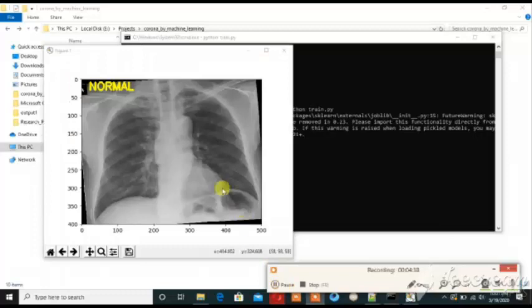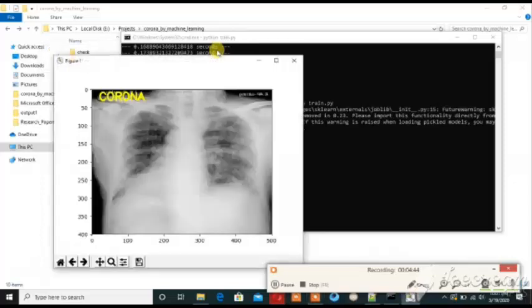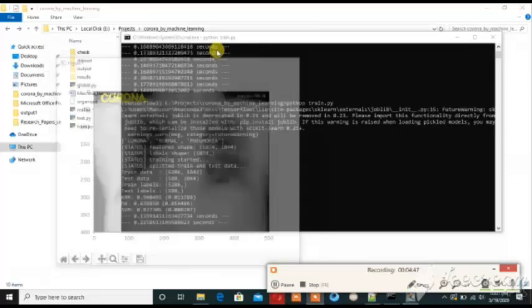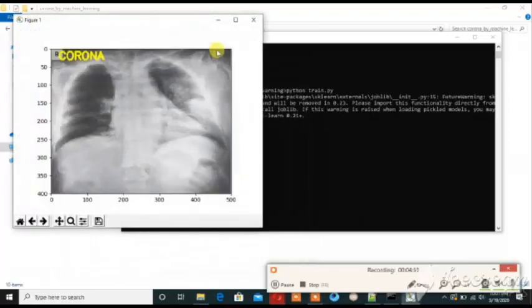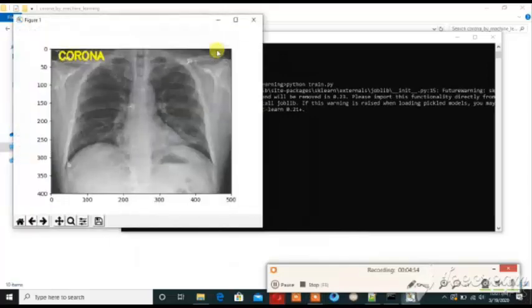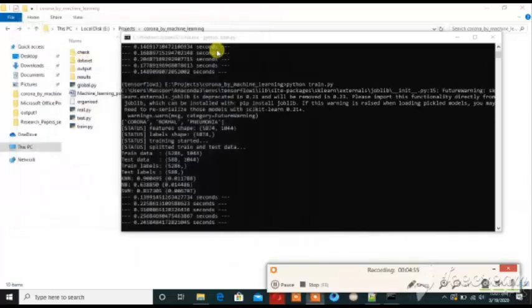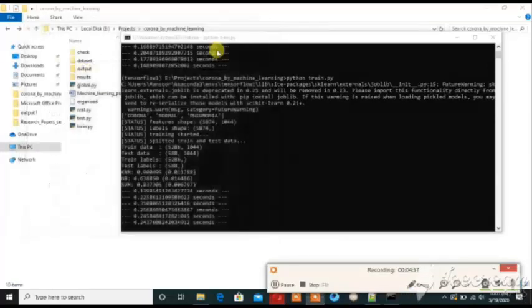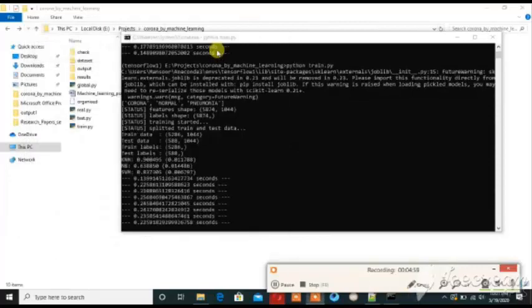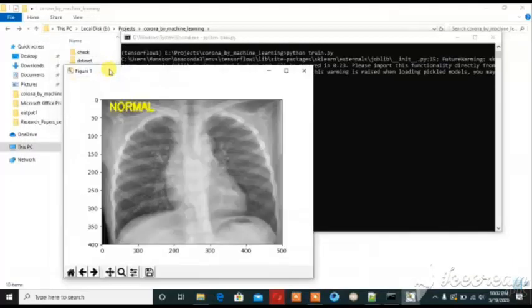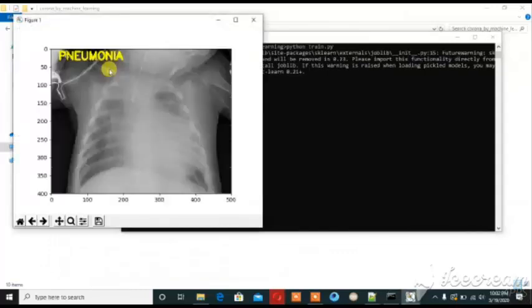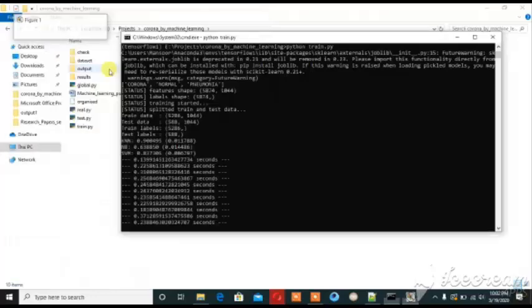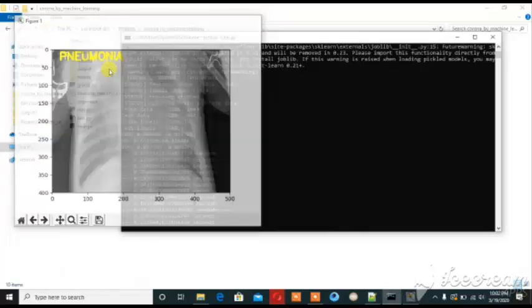This is the result of the result, this is normal, this is corona detected, this is normal, this is corona, this is corona, this is normal, this is normal, now pneumonia, this is pneumonia.